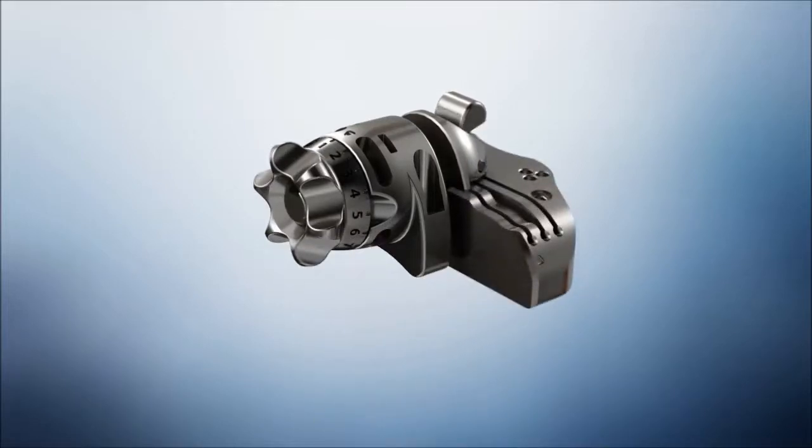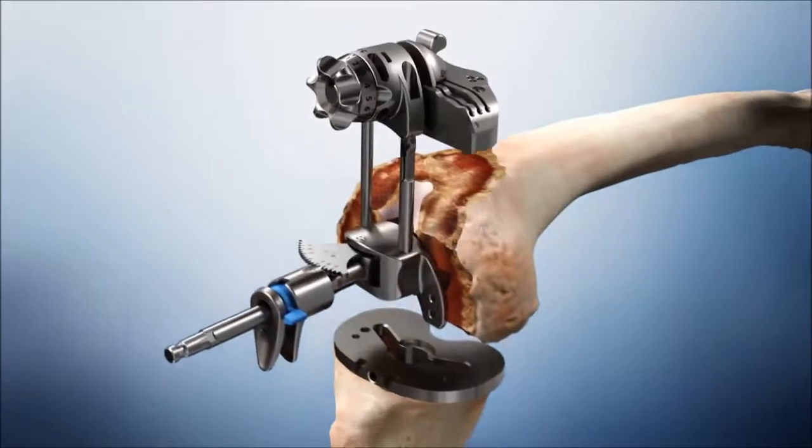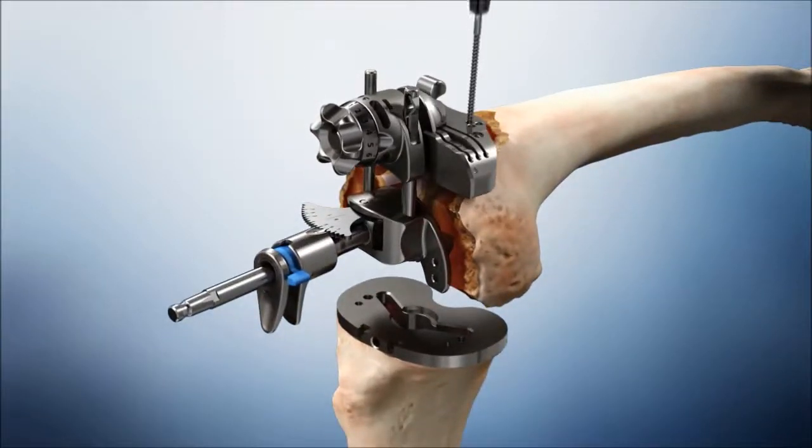Assemble the revision distal cutting block onto the distal femoral block attachment. The tang of the connector will slide into the 0 mm cutting slot on the cutting block. Assemble the resection guide to the distal femoral alignment guide until the distal cutting block touches the anterior femur. Pin the cutting block.